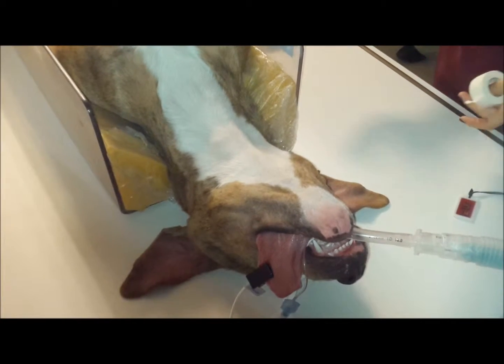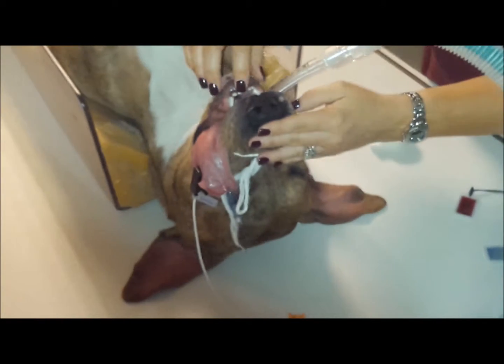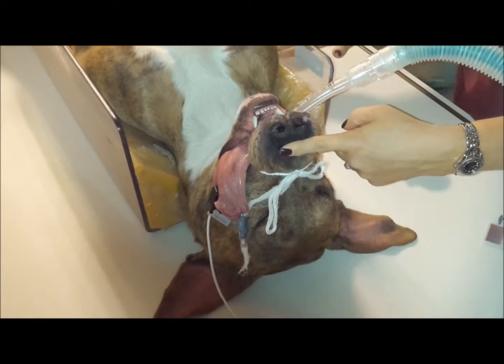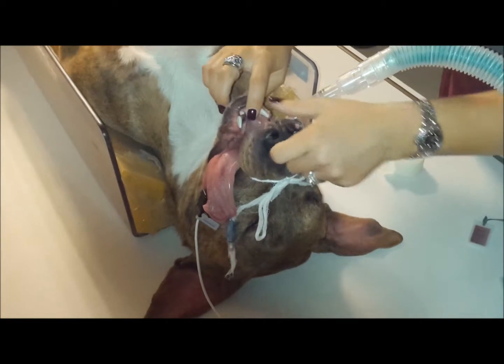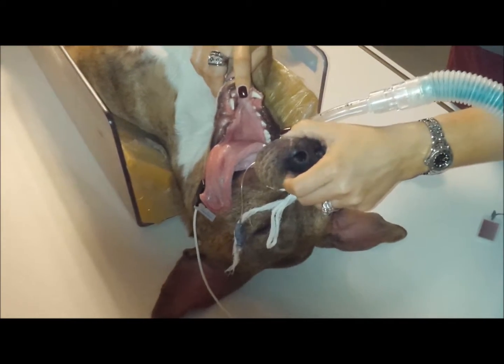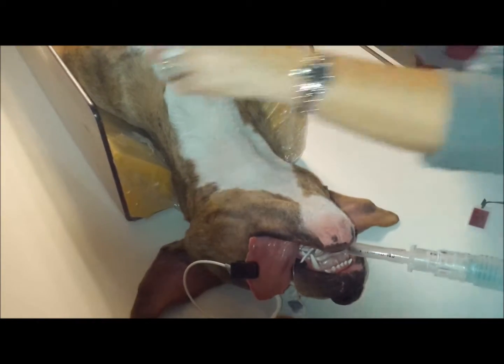This view is for the tympanic bullae. We're going to put this dog in the same position we did for the frontal sinus. We're going to have the head perpendicular to the table, but we are going to have the mouth open in a V. So you're going to use the same taping technique that you did for the frontal sinus.